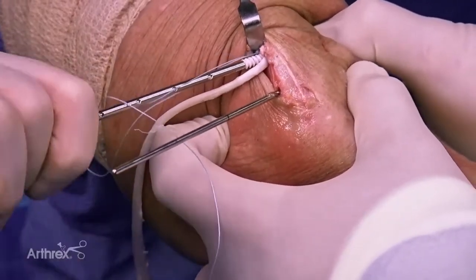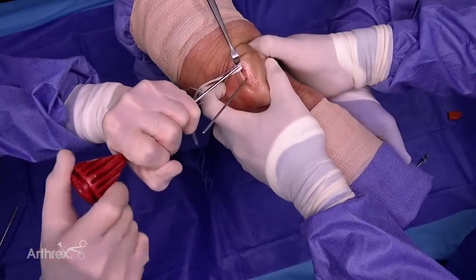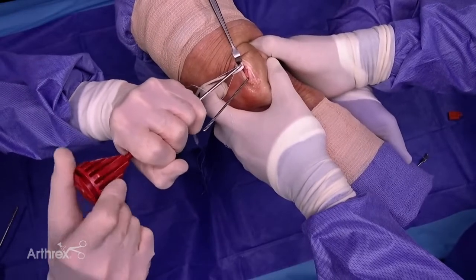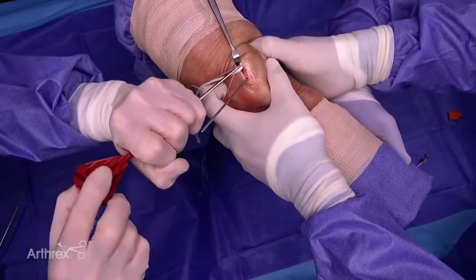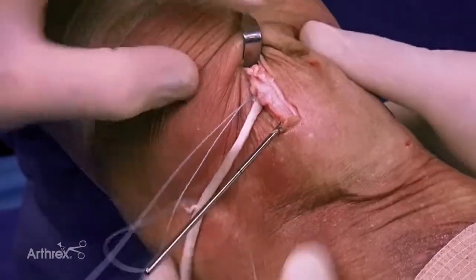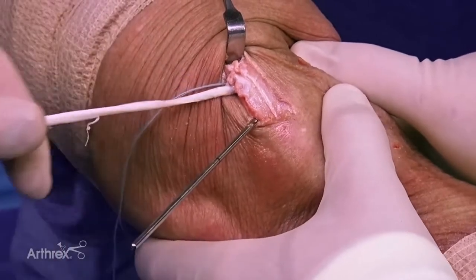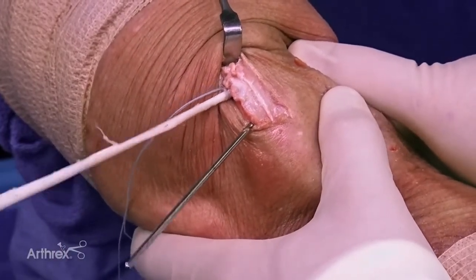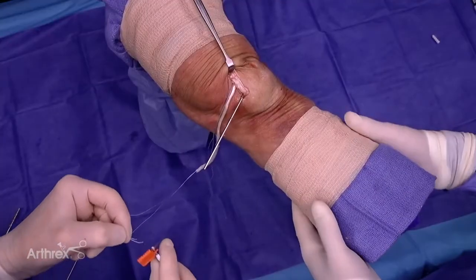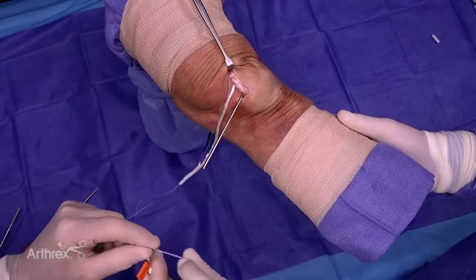I've got the sutured end of the graft in the hole and here comes the 3.9 Swivlock for fixation. You can hear a nice squeak — there's great fixation. We pop it out so you can see we have the majority of the sutured graft with good fixation with that 3.9 Swivlock. Now we load our second Swivlock for our equator fixation of the graft.